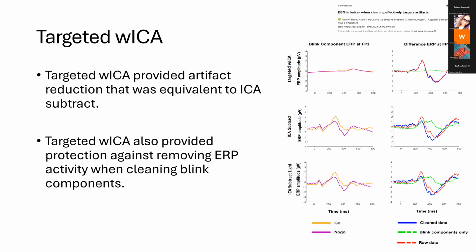And so as a result, the raw data and the cleaned data were better matched after that targeted wavelet enhanced ICA method.